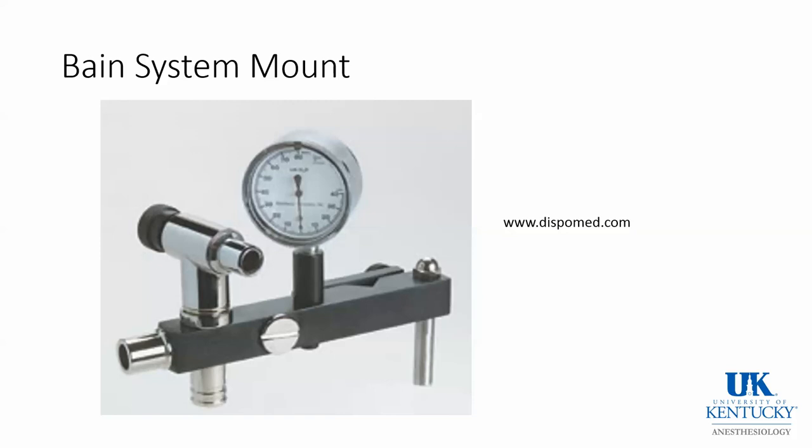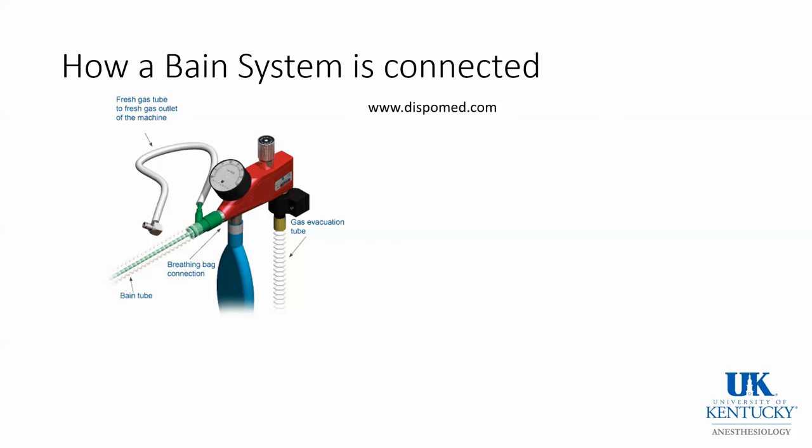This Bain circuit, this lightweight plastic circuit, was designed to be attached to a mount as pictured on this slide and on the next slide, which shows that the fresh gas flow came from the common gas outlet of the anesthesia machine, and that is the center smaller tubing shown in green in this cartoon.